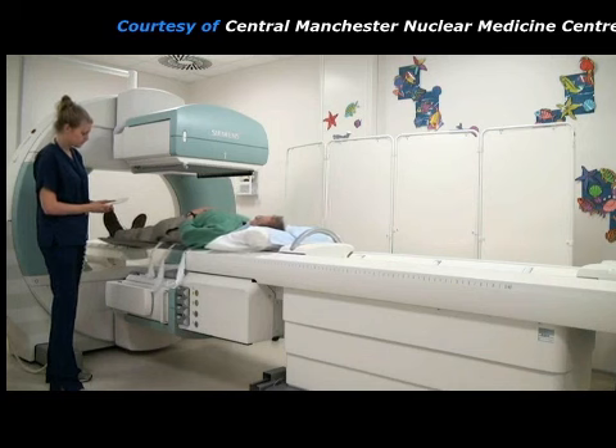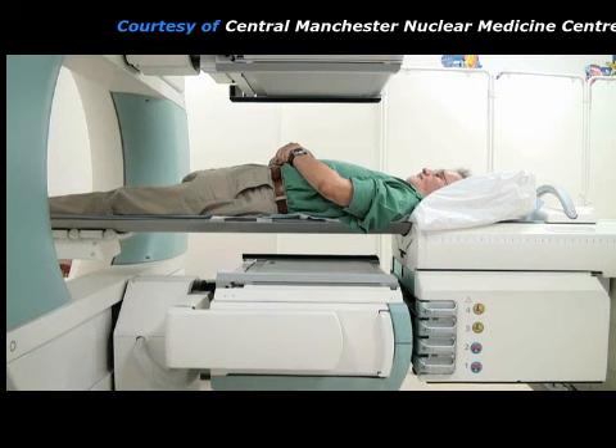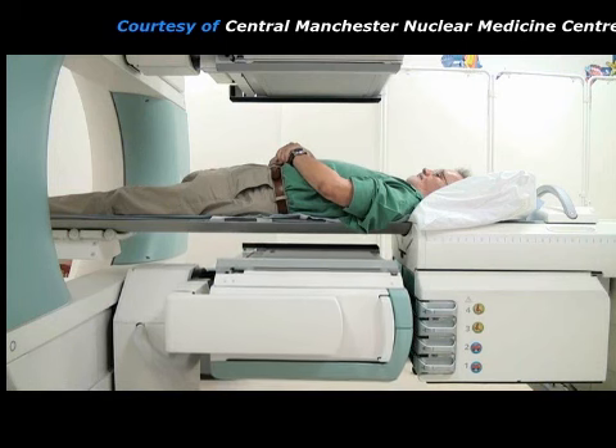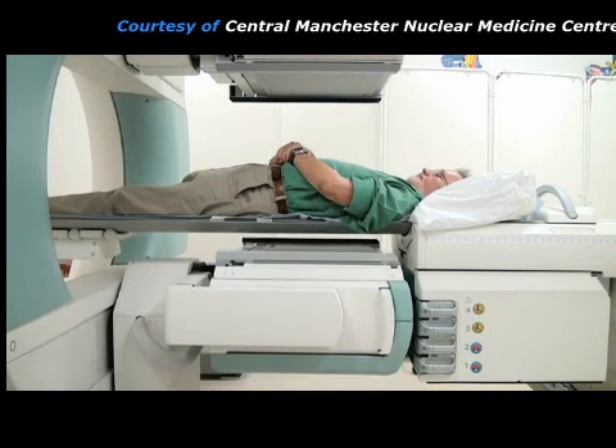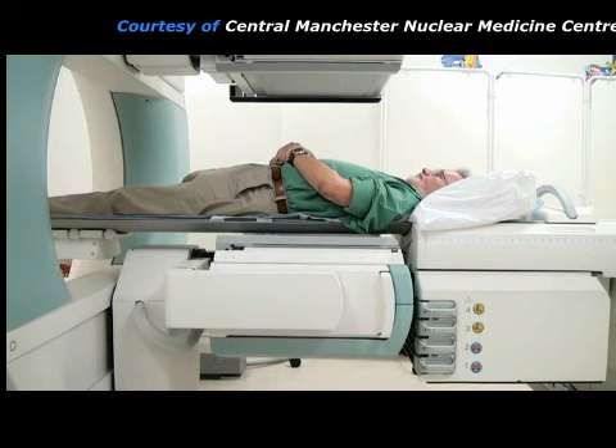Alternatively, the patient may be asked to sit up in a chair with one of the detectors behind him. The lower detector is moved close to the patient's back in order to get a good picture of his kidneys. In this case, the upper detector is not being used so it can be left far away from the patient.